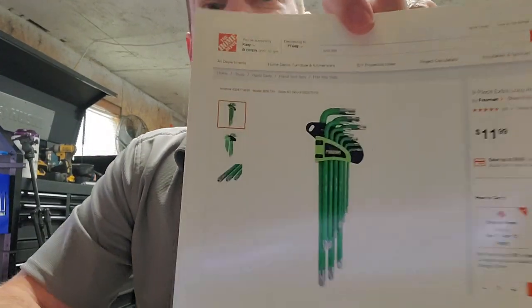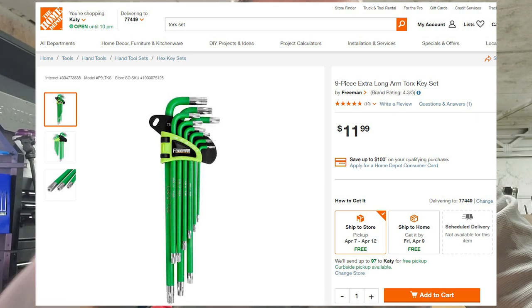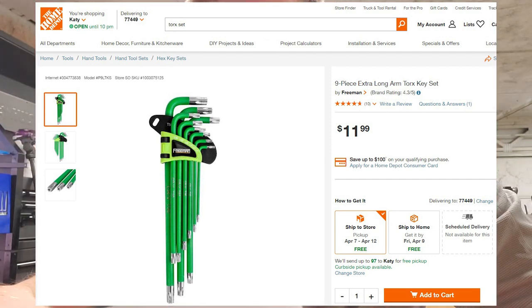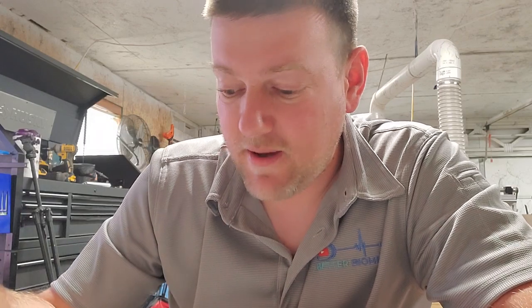We also cannot forget a full Torx set, because although the precision screwdrivers include Torx, sometimes you need to apply extra torque — that's why I prefer the L-shape. This set has a green texture on the handles, which differentiates them from your Allen keys and gives you a better grip when wearing gloves or when your hands are slippery. These flip out for easier access to the wrenches behind. They go from T10 all the way up to T50, because some equipment does use large Torx heads. It's a nine-piece extra-long Torx set at $11.99 — you really can't go wrong.